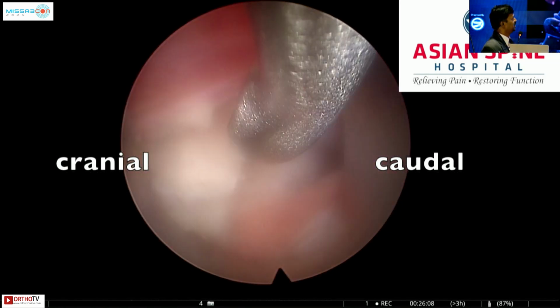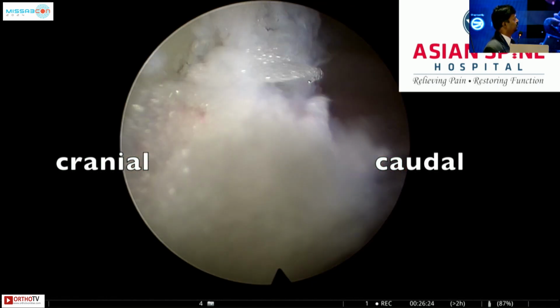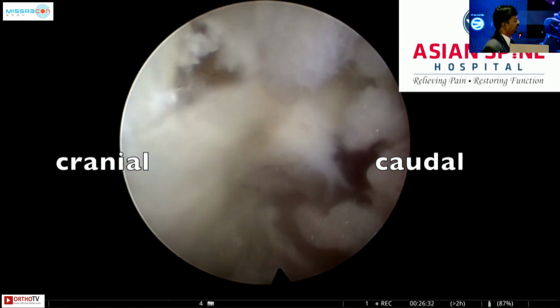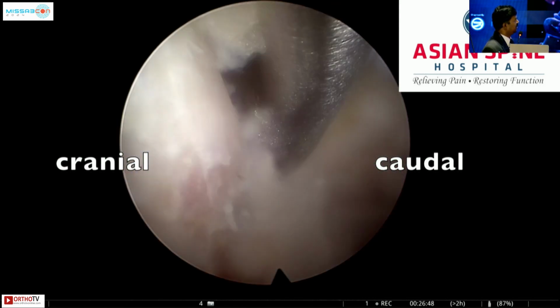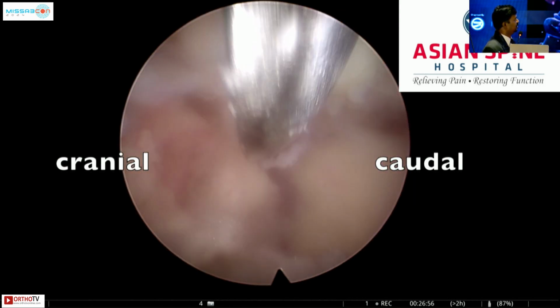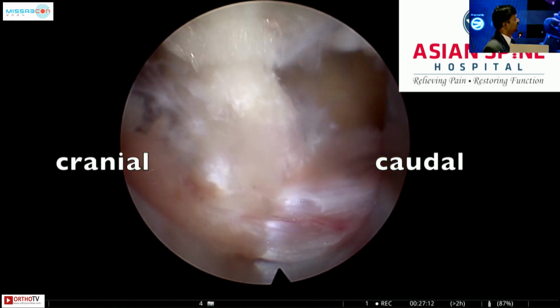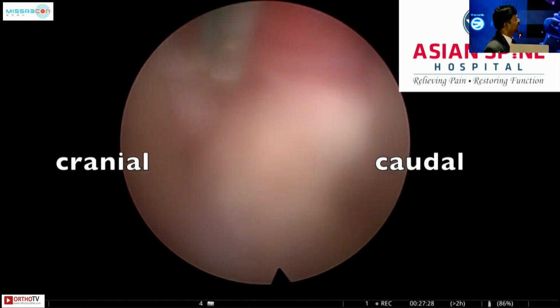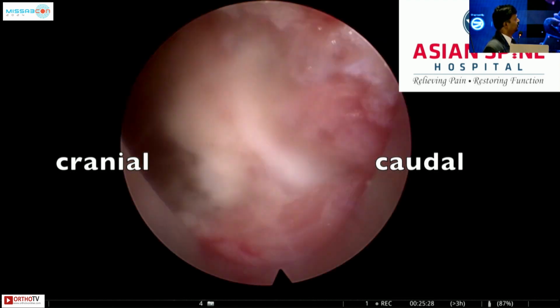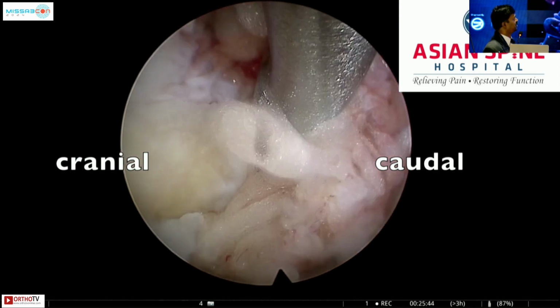So you can see the entire bone started lifting up. Once this entire bone is lifted up, as a beginner you need not worry. Always you can make it two pieces or three pieces and remove it, so you need not struggle initially. Once this is entirely floating, then grab it with a heavy tooth punch.